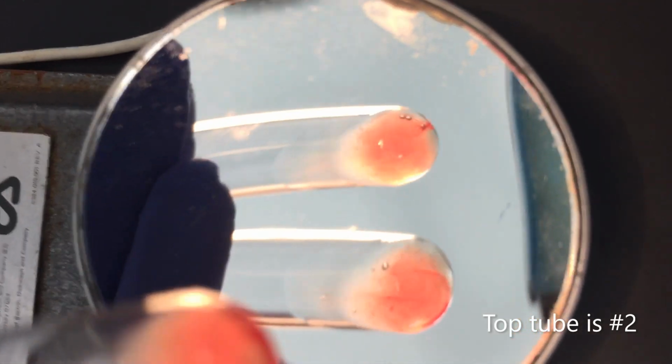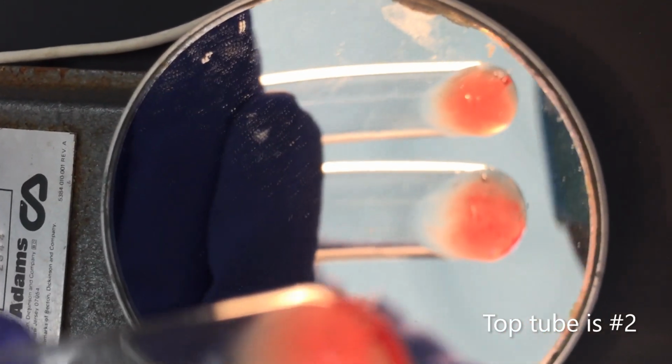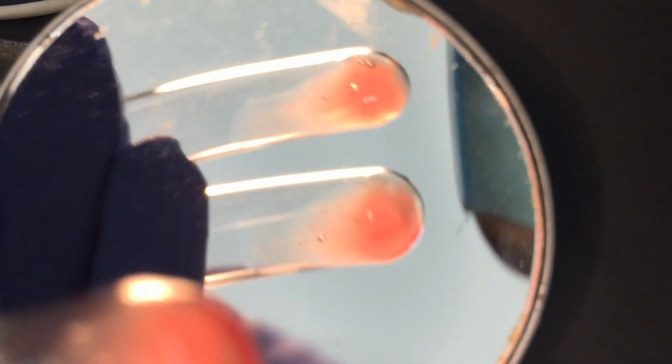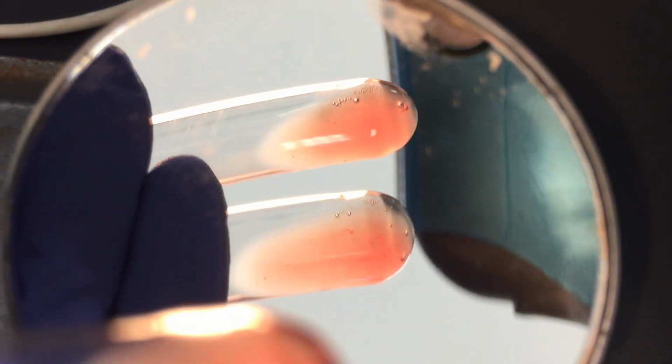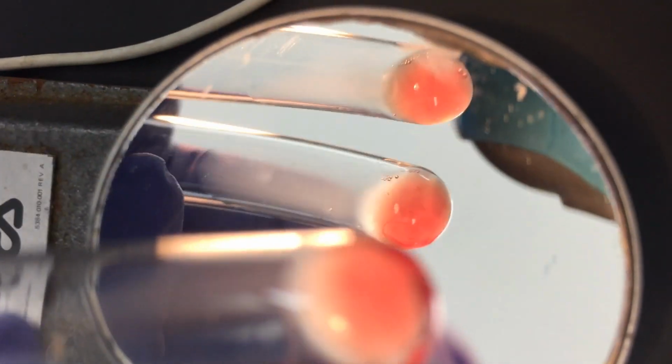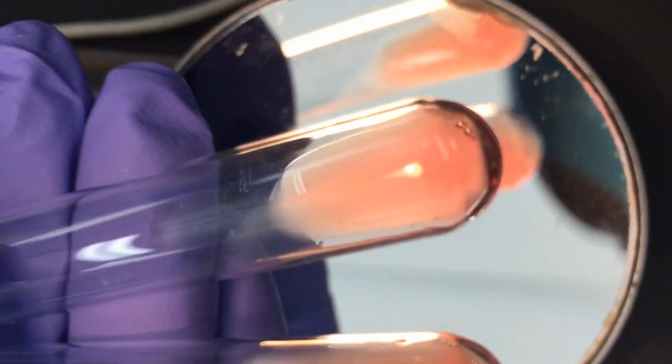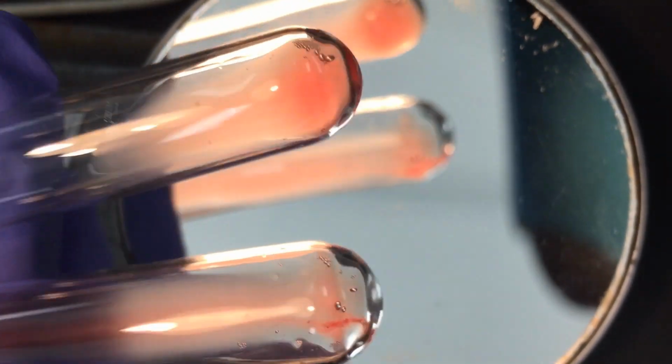Okay, when you look at your worksheet, this is what you're going to record under RT saline, or room temperature saline. All right, so this is tubes 1 and 2, samples 1 and 2. 1 is on the left, 2 is on the right. Okay, 1 and 2.